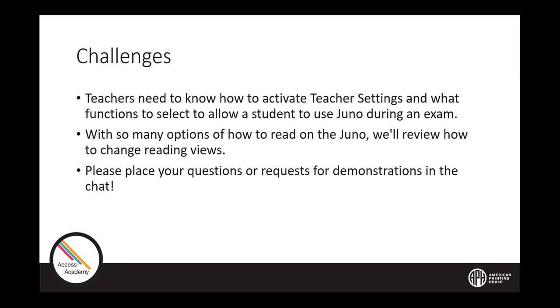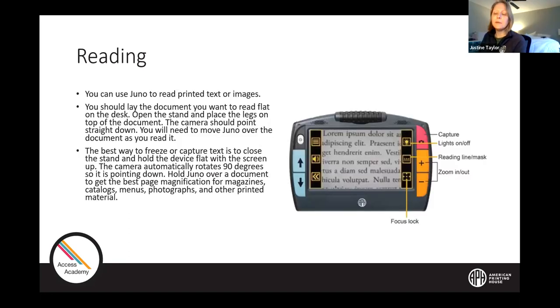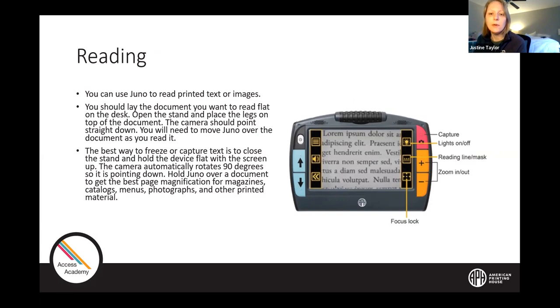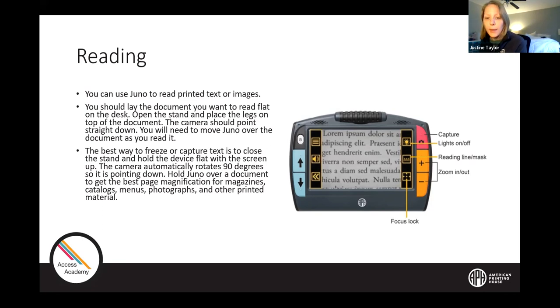Let's get started. We're turning it over to Justine to begin. You can use Juno to read text and images. What you'll want to do is lay your reading materials flat on the desk or table, open the Juno stand, lay the Juno flat on the book or worksheet, and move Juno across the page as you read. That's the live view when you're using Juno's camera.